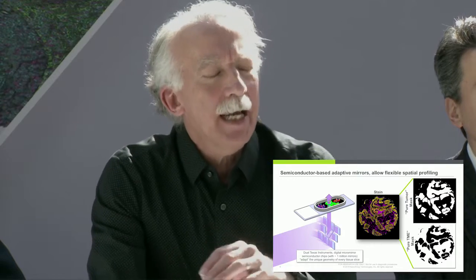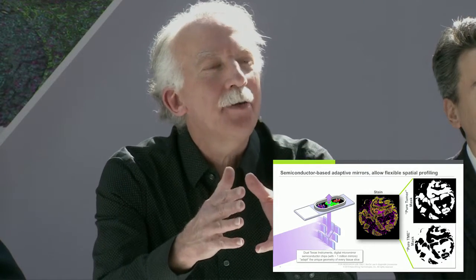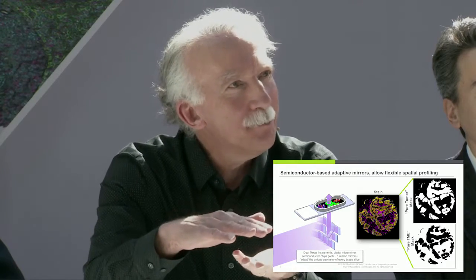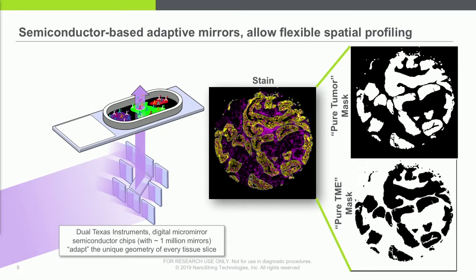Now, one of the unique aspects of this particular microscope is that it actually will record an image, like you see in the center of this particular slide, which is a colorectal tumor tissue microarray.